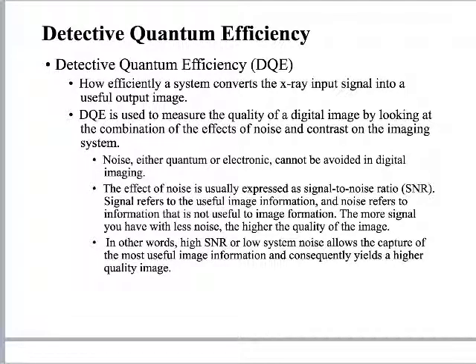All of this, these basically four different systems that we've looked at, but really direct radiography, and then the direct digital, and then the indirect systems that we've talked about. The big question that guides development and where we're trying to push the state of the art has to do with detective quantum efficiency, the DQE.